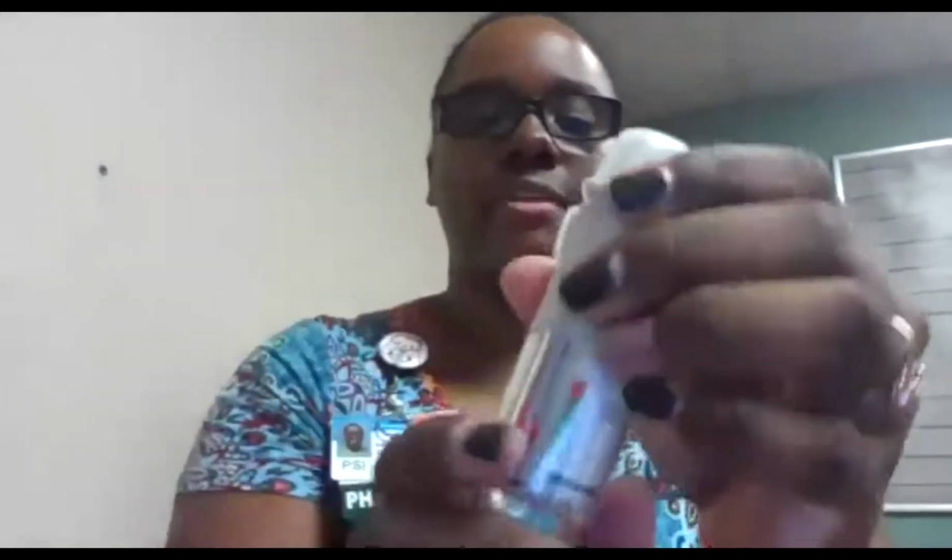So you're going to form a tight seal around the mouthpiece, and you're going to inhale slowly. You don't necessarily have to inhale sharply with this one. This is called a soft mist inhaler. So when I release it, as you'll see now, it comes out like a very soft mist. When you press the button, you're inhaling at the same time. You hold your breath for at least 10 seconds or as long as comfortable, and then that's it. If you're prescribed a second dose, then you'll have to turn it again to load your second dose, then repeat the steps, press the button, and that's it.